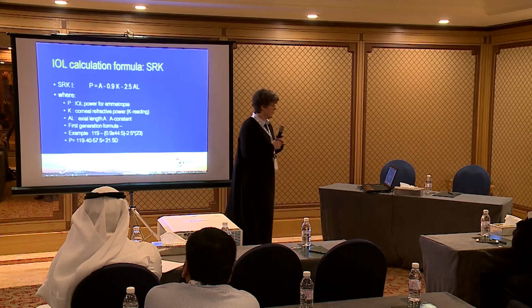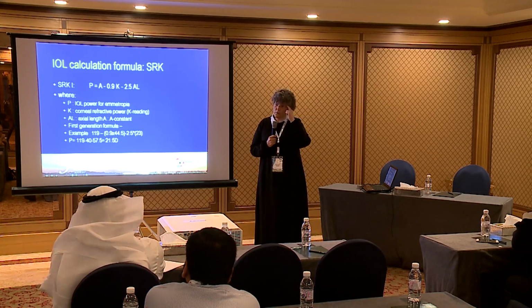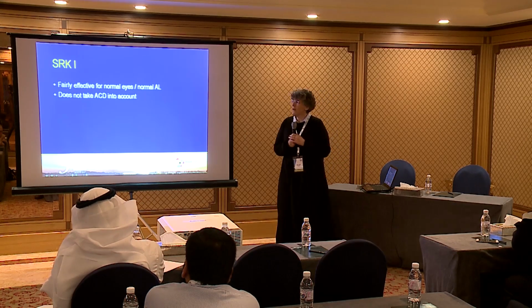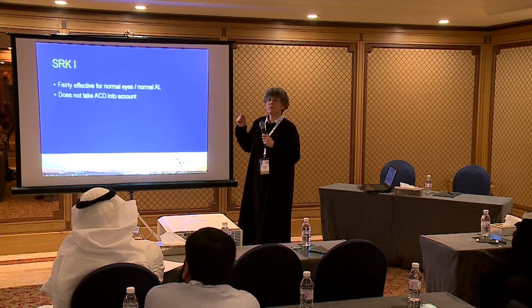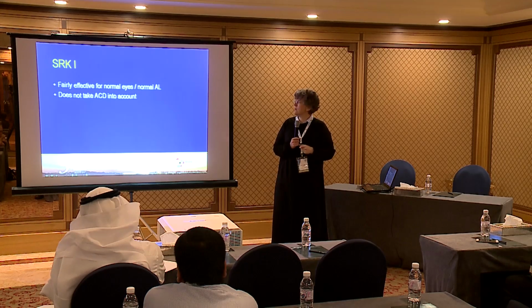Sounds familiar, right? So this is offhand. If you don't have a calculator in the room, you can just do this on the top of your head. It's fairly effective for normal eyes. So this has been working for us from the 70s to the 80s. We haven't been using anything else. A lot of people even used it in the 90s.